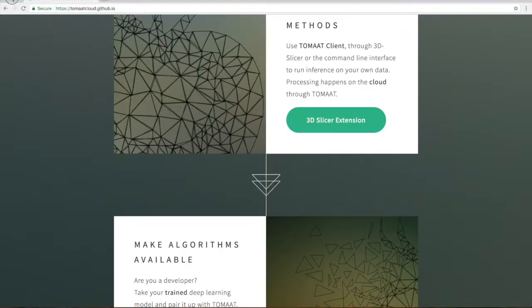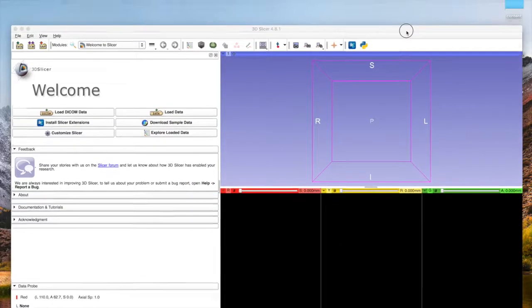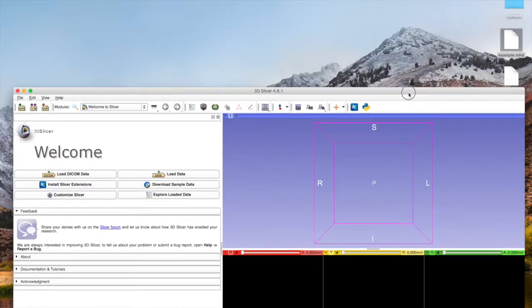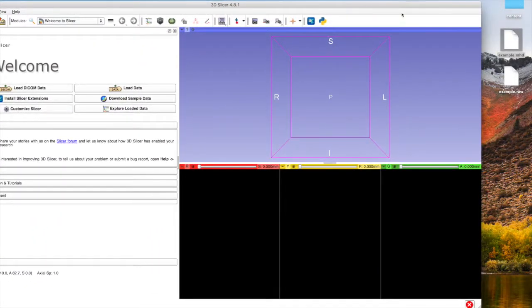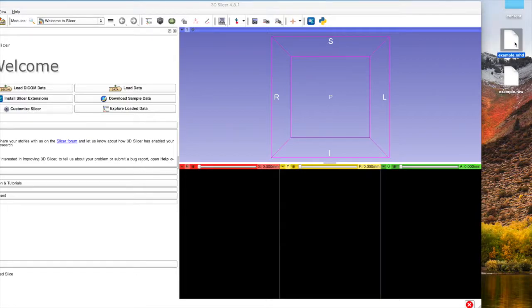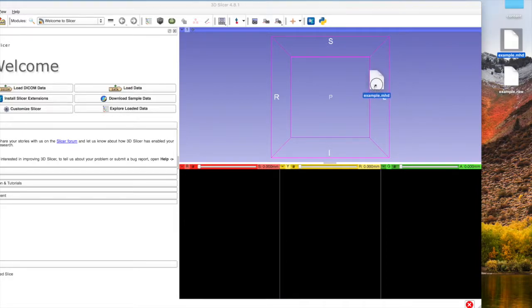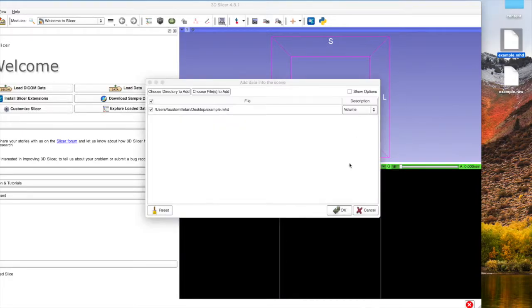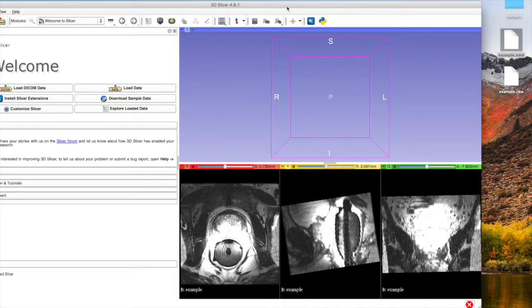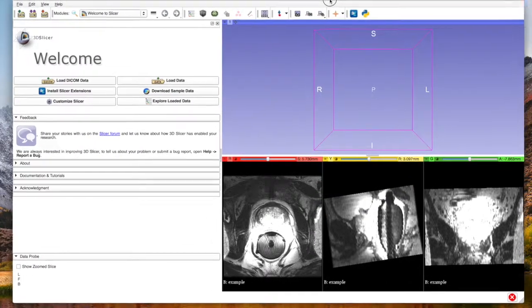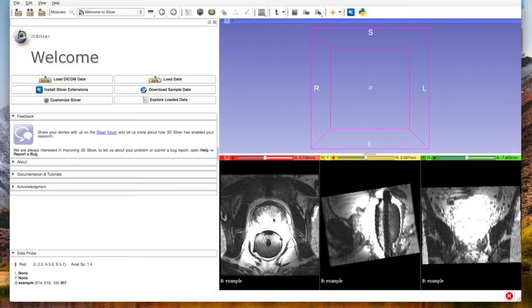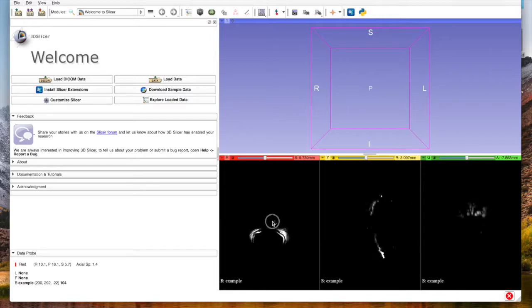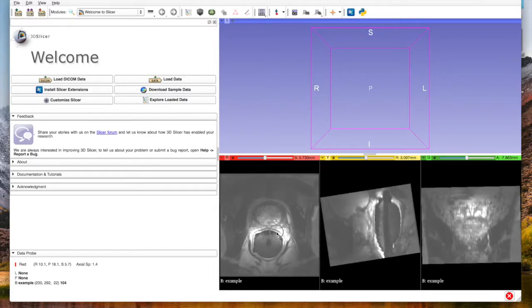Then restart Slicer, and at this point we can load into Slicer some medical data, such as this image here, example.mhd. MHD is a common file type for medical scans, especially used in research. Of course, Slicer is compatible with most of the medical image formats out there, and here we can see that we have an MRI scan of the prostate.